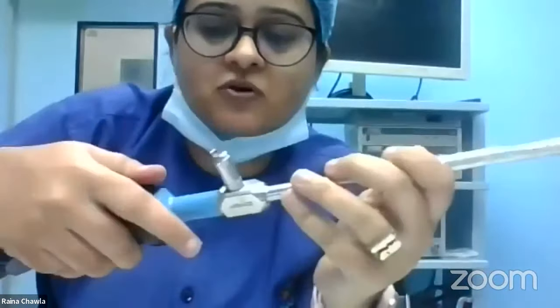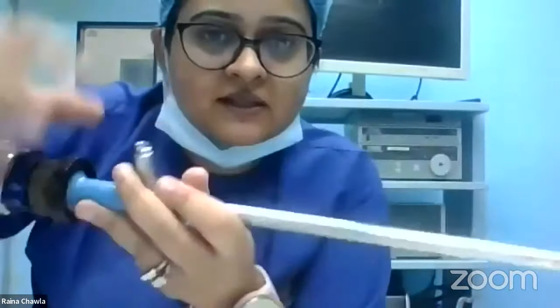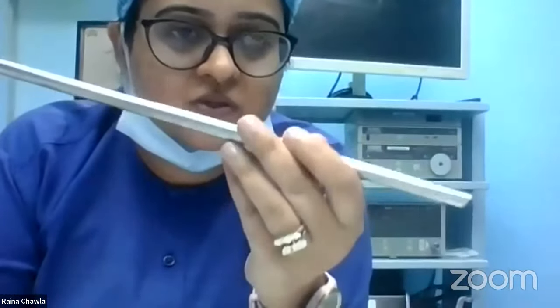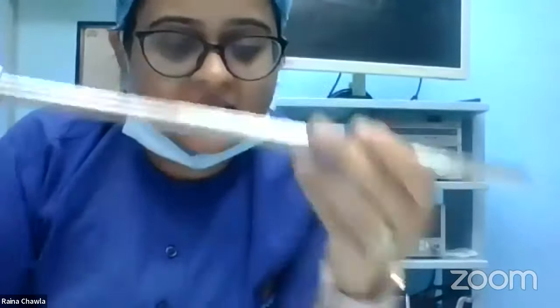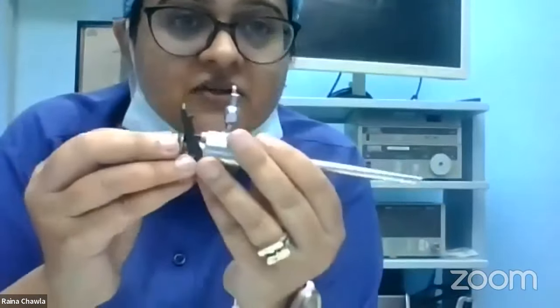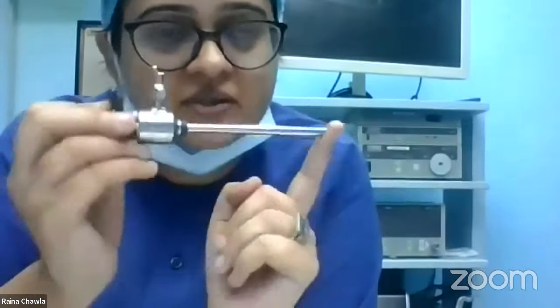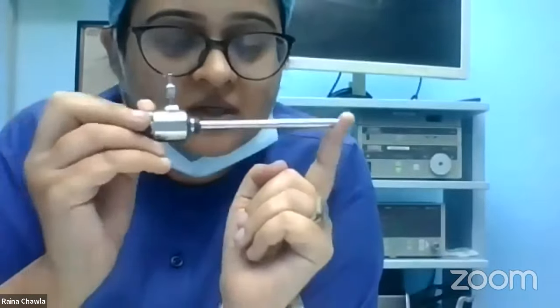Through the primary port, we introduce this instrument. This is the laparoscope. We attach the camera and the light source, and this will show us our field of surgery. And then we operate using the instruments which are put in the secondary port. So we can have one secondary port, usually if it's a diagnostic procedure. If we're doing a hysterectomy, we may need up to 3 or even 4 ports. Okay, so I hope this is clear, laparoscopic surgery.